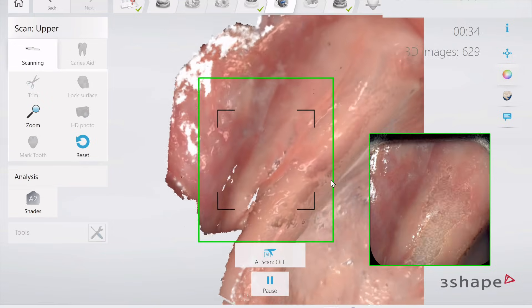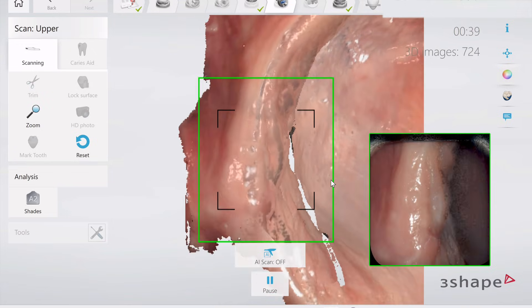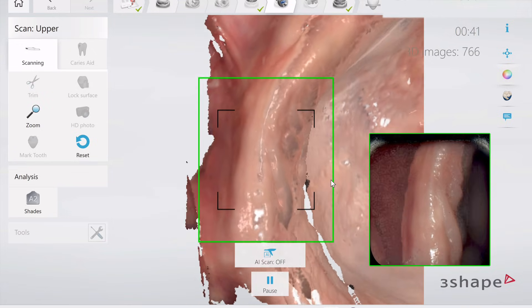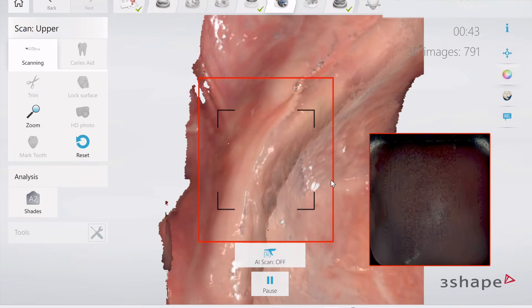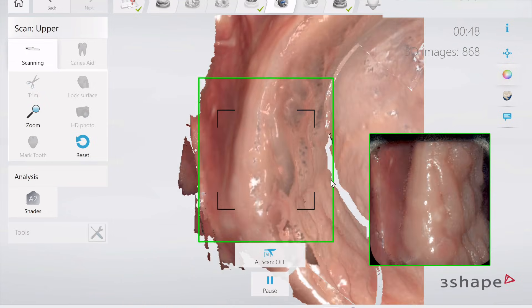Then I go ahead and do a hemi-scan of the borders. With the Mod Retractors in place, we're going to have an extended border here with the tissues stretched tautly, and this is going to allow us to see the muscle attachment to the ridge if we're designing on this mucostatic scan.